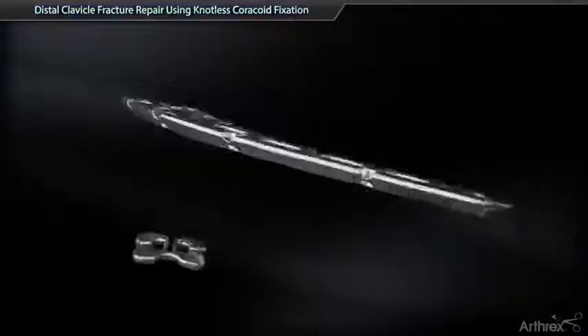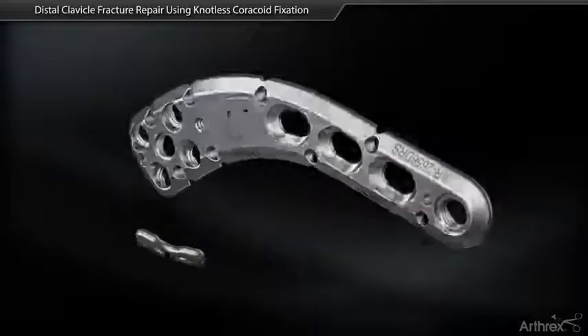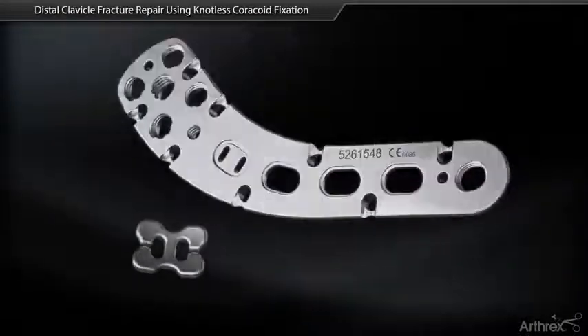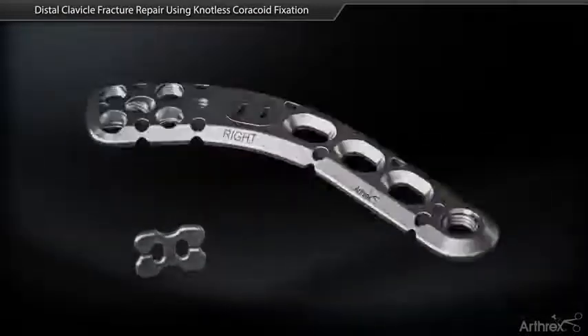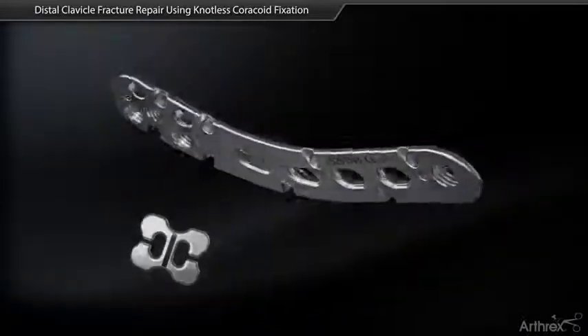The Arthrex clavicle plates are ideally suited for fixation of mid-shaft and distal clavicle fractures. Stability of distal fractures can be enhanced by integrating coracoid fixation into the plate using a knotless plate button and a dog bone button.